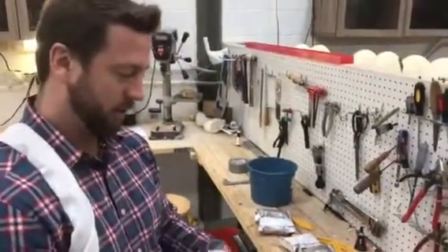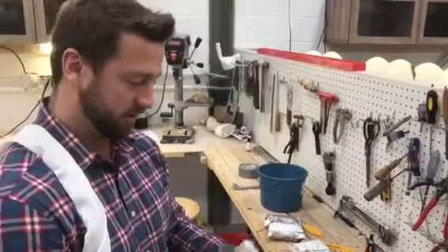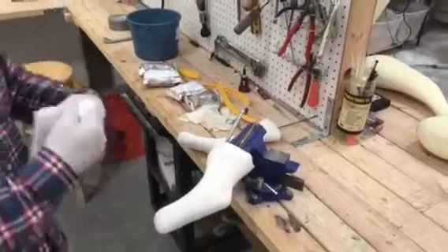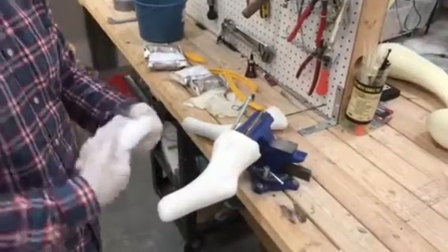Today we are casting for a forelimb prosthesis, a front leg. Usually we'll see a mold like this. I'm casting on the mold today just for ease to show you guys exactly what to do.